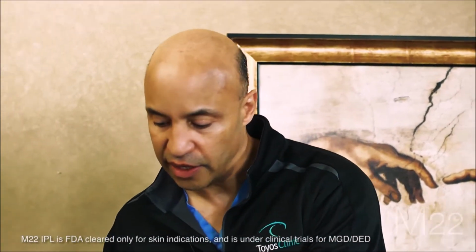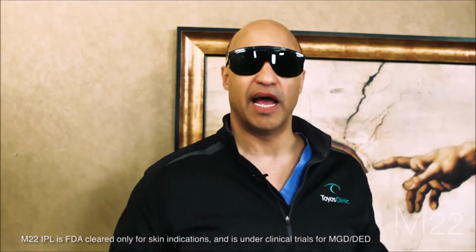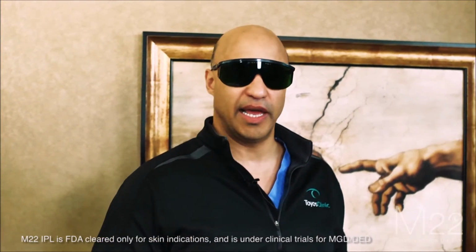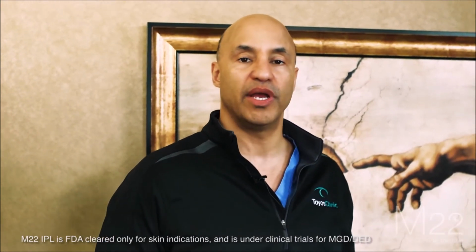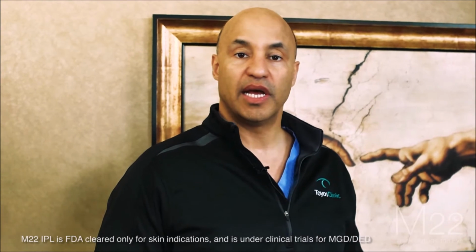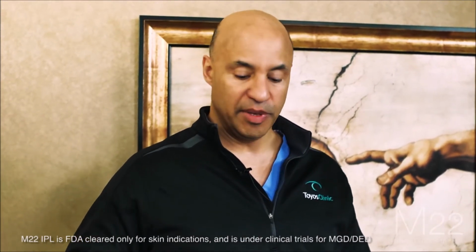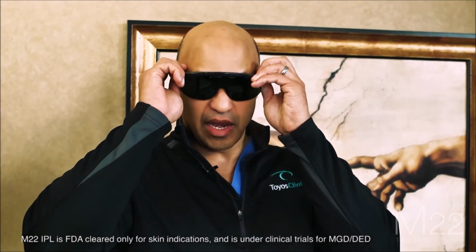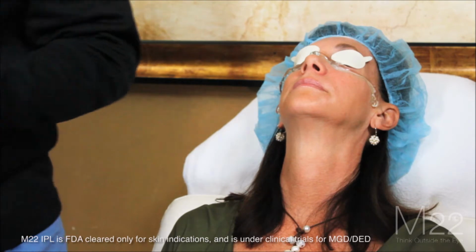Now, when you're starting, I would recommend wearing some eye shields to block the light. I've been doing this so long, I have the ability to close my eyes at the point of treatment so that the light doesn't affect my eyes. But I think in the beginning, go ahead and put your goggles on. And we're going to start treatment.